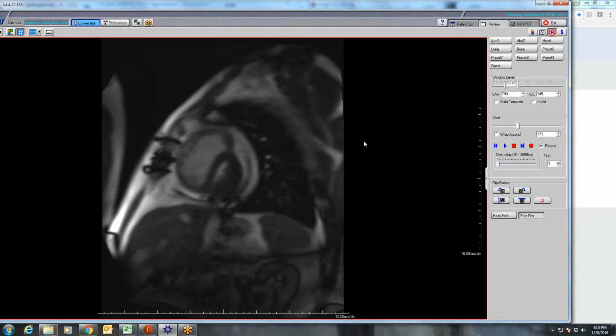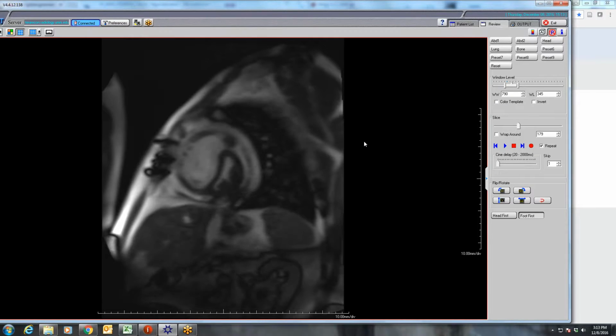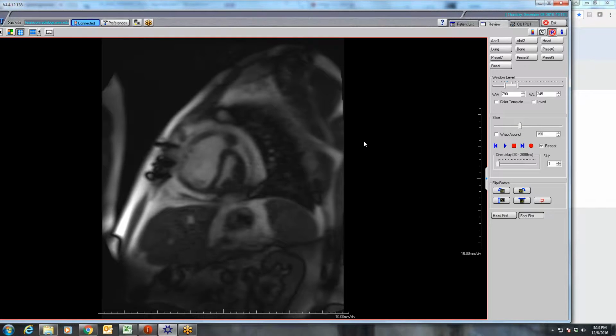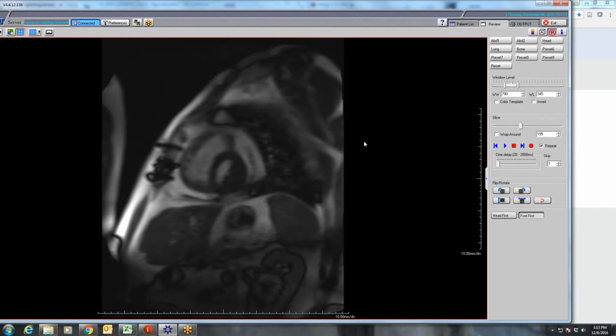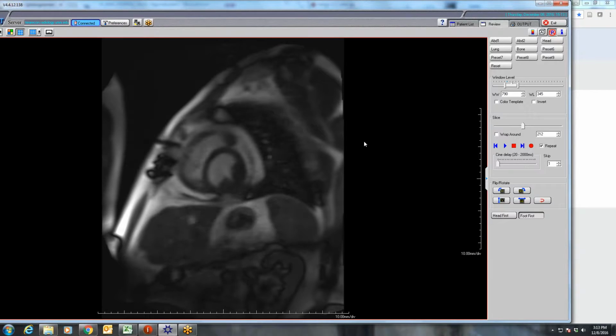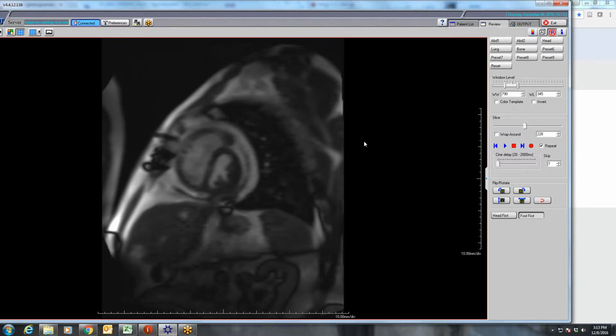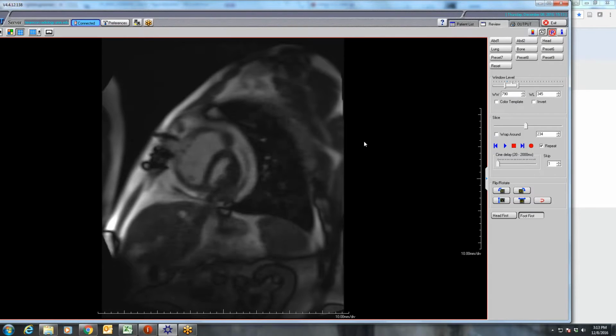During inspiration, you decrease right atrial pressures, you increase volume into the right atrium, and the right ventricle fills first. Then, because of ventricular interdependence, you get a very rapid increase in right ventricular pressure compared to left, leading to this dramatic bowing during inspiration, which you can see very early, really pronounced, like right there. When it speeds up to regular time and you play it in a regular viewer, it's quite nice.